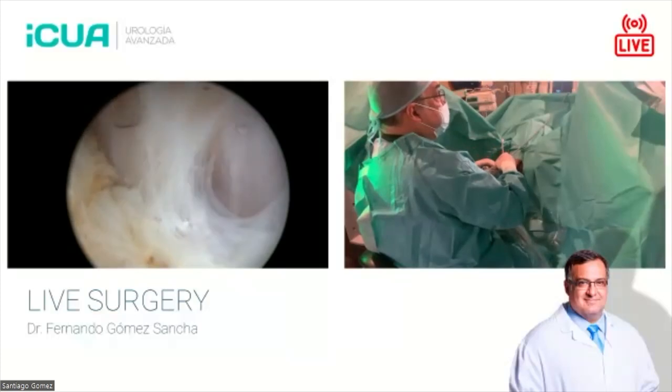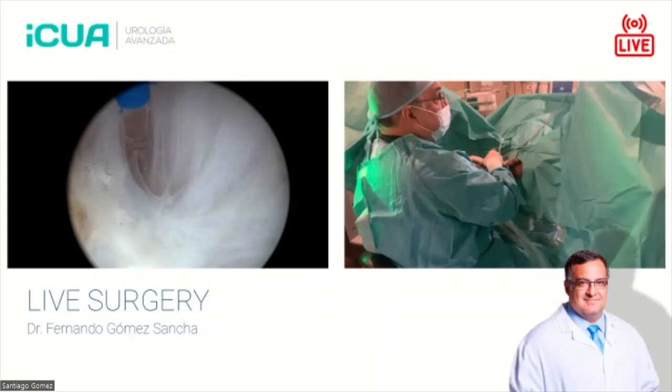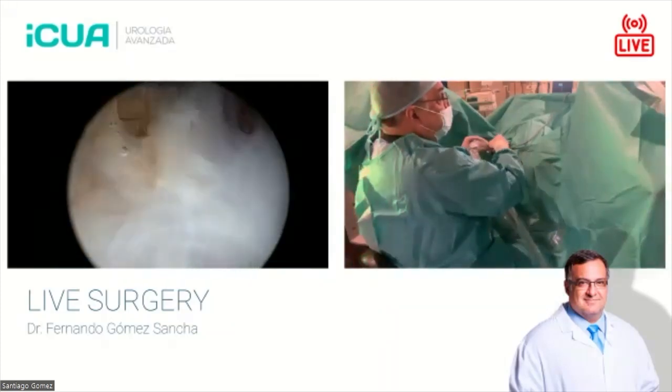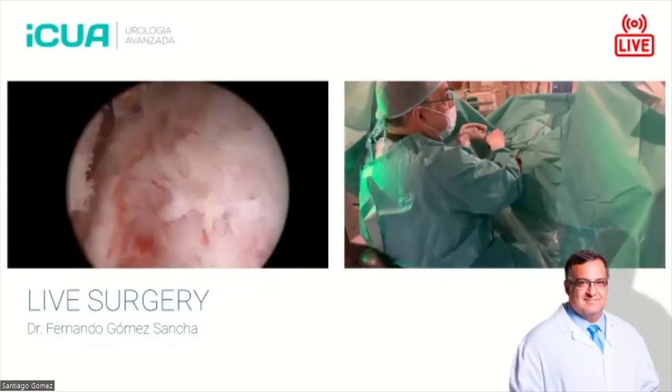Here, for example, we have a nice example. You see that the capsule is looking thinner here. So I don't want to fire against this. I want to fire closer to the adenoma. You see, I'm correcting my plane so that it doesn't go very, very deep.